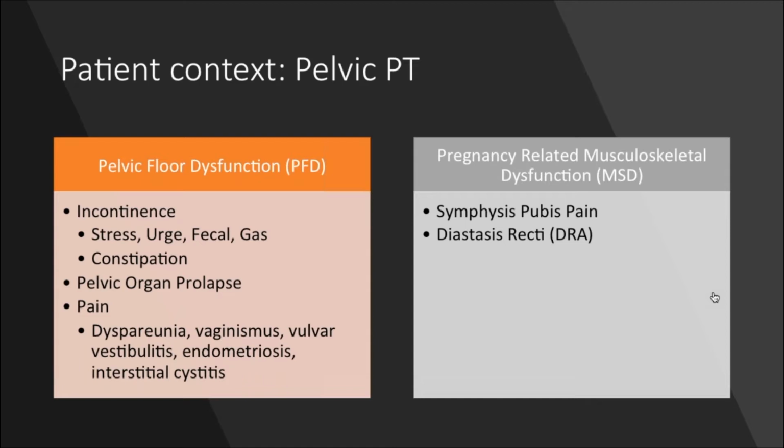And I do want to reiterate that ultrasound imaging is a bit newer and not necessarily in all practices in the States. It's a little bit more dominant in the global community as opposed to biofeedback, but we'll talk a little bit later about what the differences are between the information that you can gain from each source. There are some therapists out there that will look at post-void residual as far as ability to empty the bladder. We're going to focus primarily on the musculoskeletal aspect and the muscular control and coordination in this discussion.